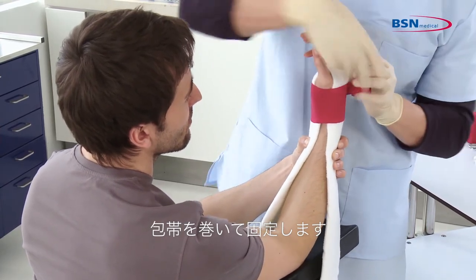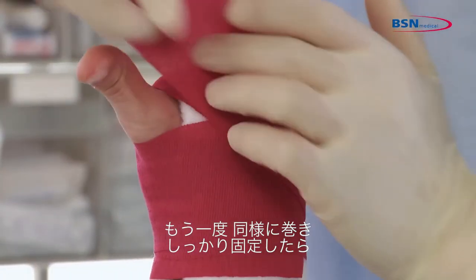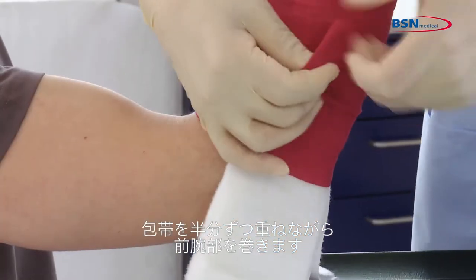Wrap with a bandage to secure the splint. Begin at the wrist and go through the web space. For better immobilization, repeat this step again. Proceed down the arm with overlapping 50% of the bandage.